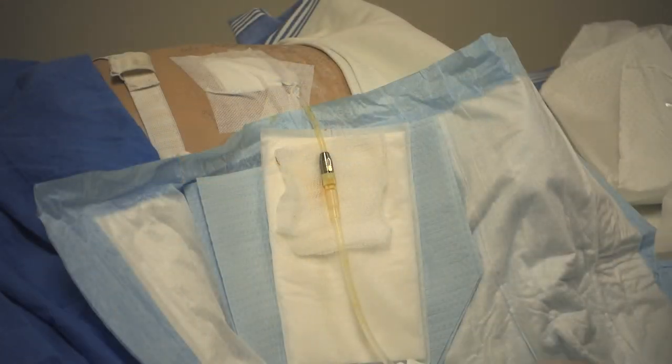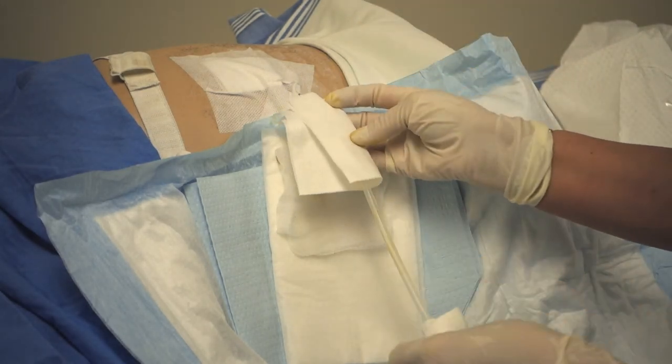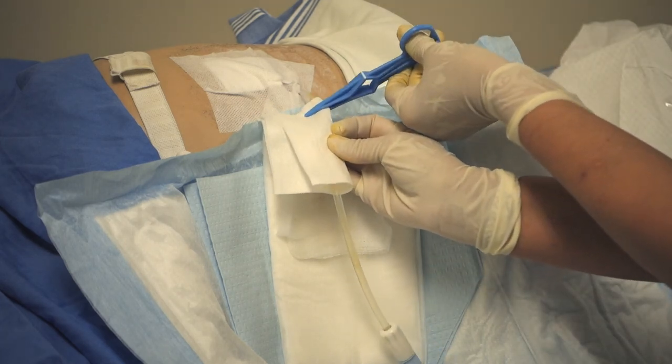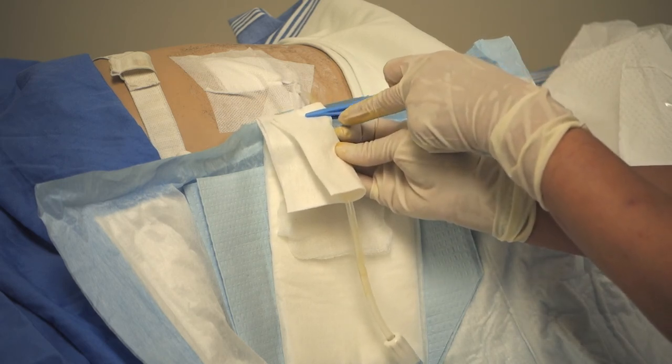You will remove the povidone iodine gauze and lay it down to dry — it must dry completely. Pull the new gauze around the connection site and clamp the catheter with the clamp from the dressing tray. Be sure that there is a gauze between the clamp and the catheter.